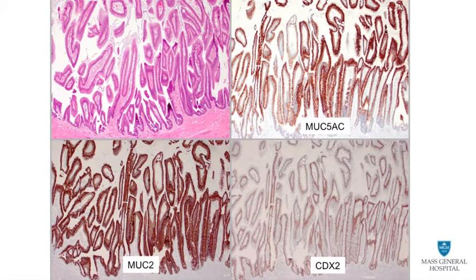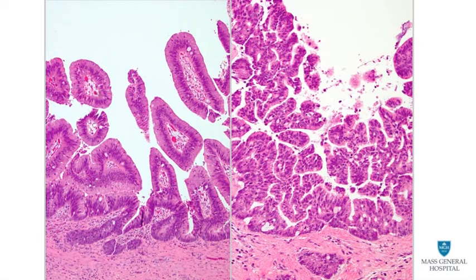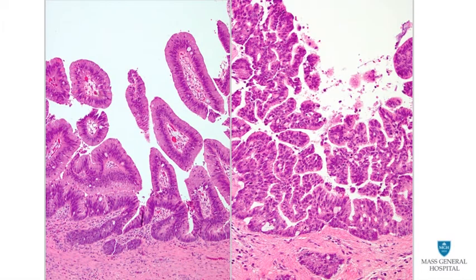Immunostains for glycoproteins reveal that the epithelial cells are marked by MUC5AC, which is a hallmark stain of IPMN, as well as MUC2, an intestinal glycoprotein, and CDX2, an intestinal transcription factor. The results are consistent with intestinal type IPMN. The duct lining epithelium exhibits a spectrum of dysplasia from intermediate grade, shown on the left, to high-grade dysplasia on the right. High-grade dysplasia is characterized by small but complex villi with high nuclear cytoplasmic ratio and lack of nuclear polarity.